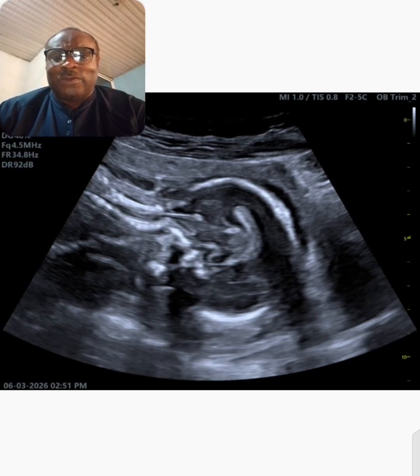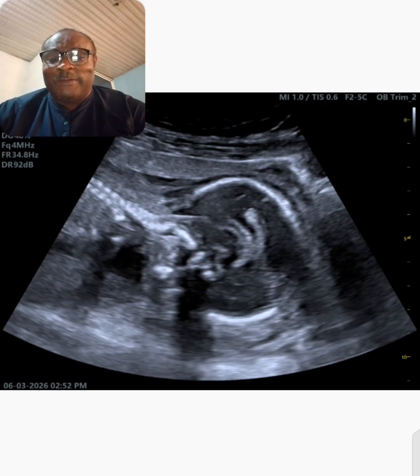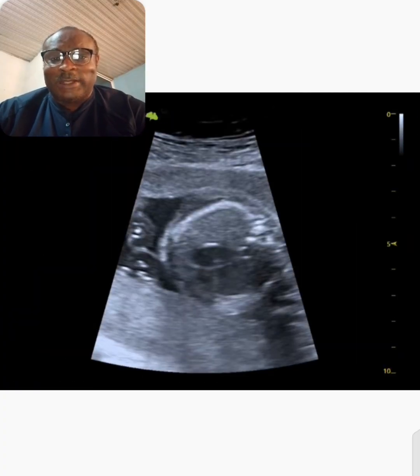Okay, so remember the questions posed. Where is the placenta? Where is the placenta location? Is this a baby boy or a baby girl? We need you to give the answers in the comment section.